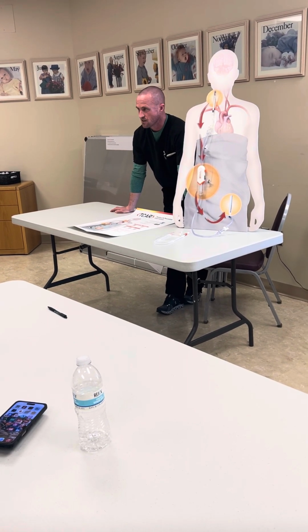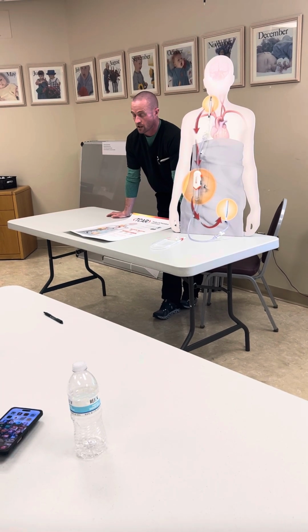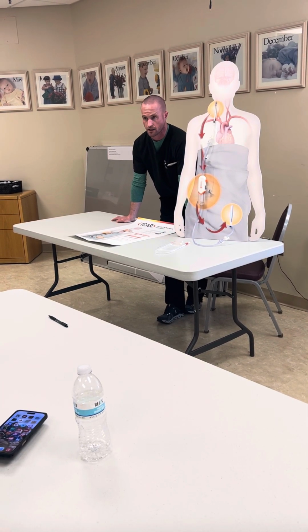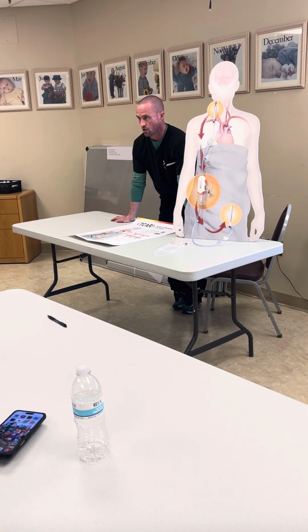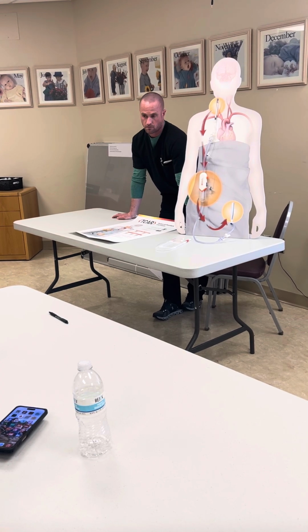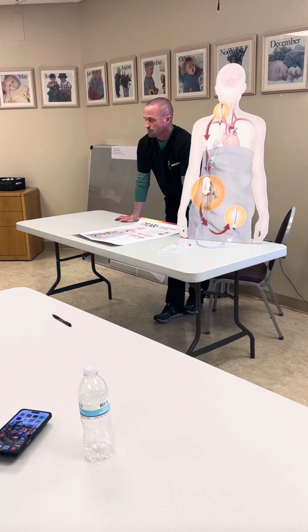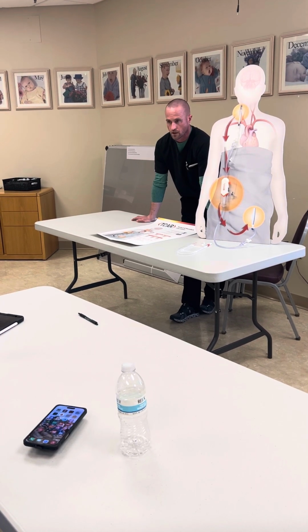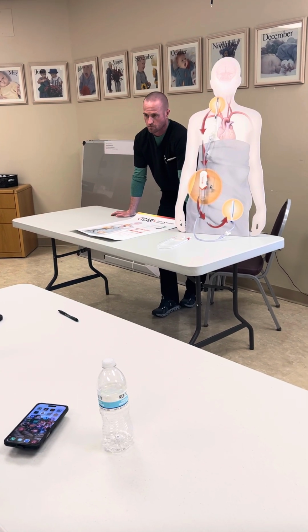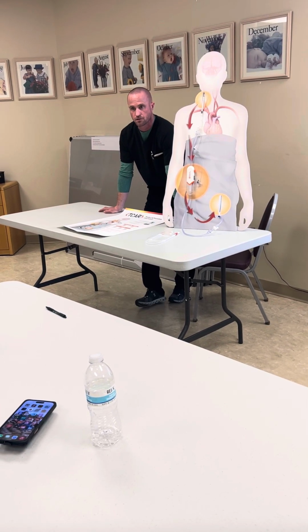Yeah. And the glyco, I get a lot of pushback on the glycopyrrolate. We actually had an anesthesia speaker that worked for us that went around and reiterated that, like, all day long, pre-treat. I've had 3 where we chose not to during the case. And I get it, the patient's rates were like 110s, and they didn't want to elevate it any further, but those are the patients that as soon as we ballooned them, we were asystolic, and then we're chasing both heart rate and pressures the rest of the case.